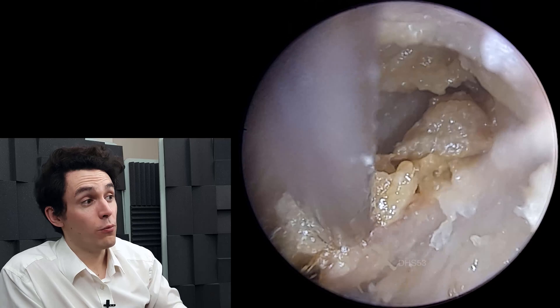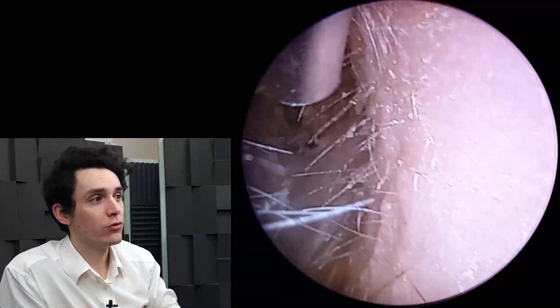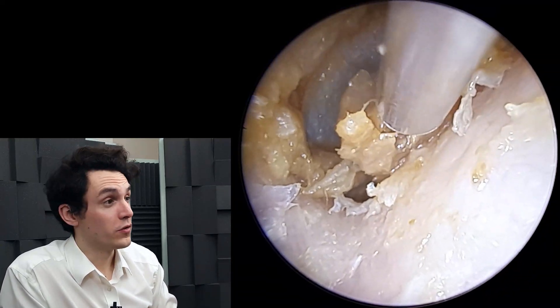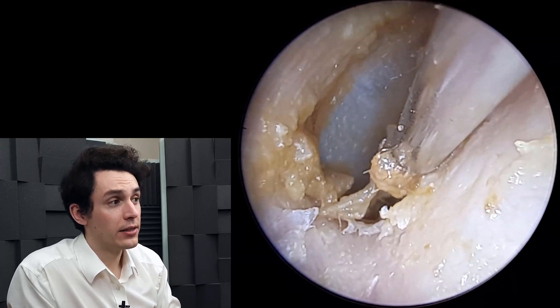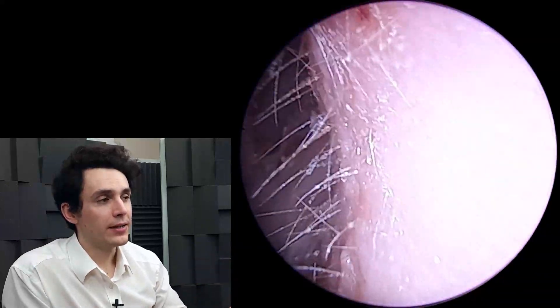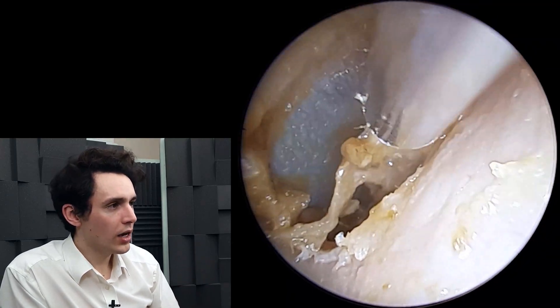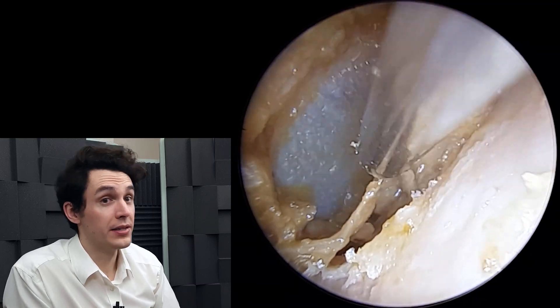One thing to note is that the wax looks not its usual brownish color — it looks almost like a pale yellow. And that is the effect of the hydrogen peroxide, so it does change the color slightly. Sometimes it can be mistaken for infection. If the hydrogen peroxide has had this kind of almost bleaching effect and created quite a watery, slimy earwax, it's not uncommon for people to think the ear is infected, thinking that it's pus.